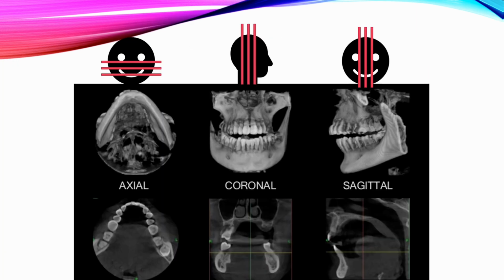You might be wondering how we are able to create a 3D or a cone-shaped X-ray beam on something that falls within the electromagnetic spectrum. We are still using X radiation that travels with wavelengths, but we are using it in 3 different directions to give us that 3D image. Remember, we get anywhere between 150 to 600 2D images that are pieced together. Dedicated software will assemble all of these images into the 3D rendering.